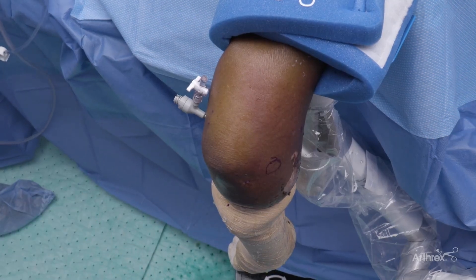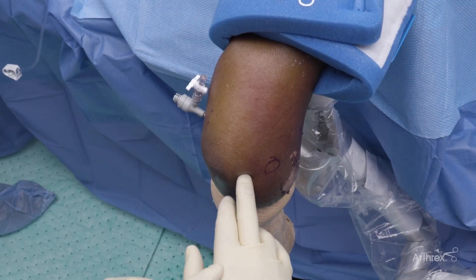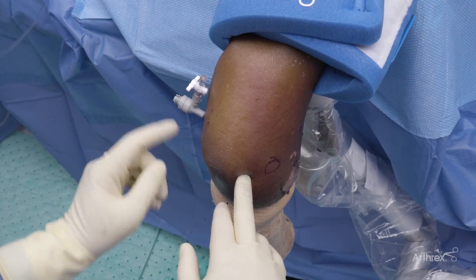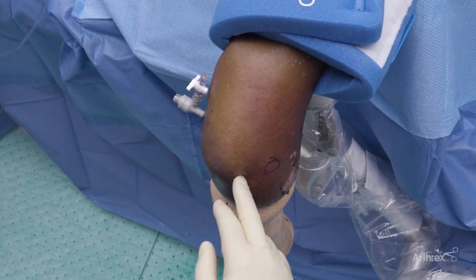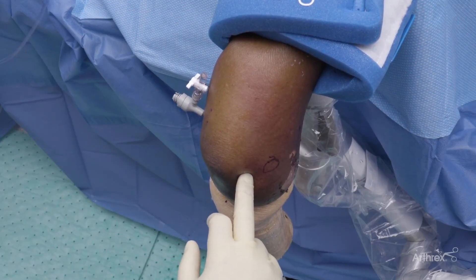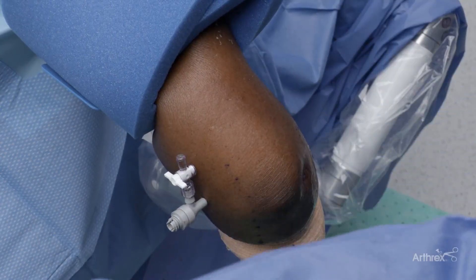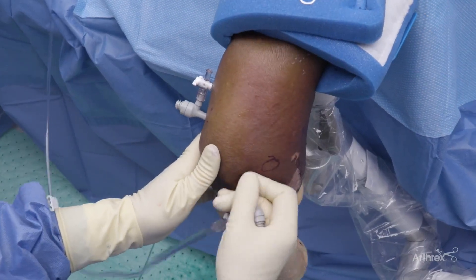After finishing the anterior work, I like to go to the posterior chamber. I use a very straight posterior portal in the radiocapitellar joint. One of the reasons I leave an anterior cannula when I first do this is that sometimes there's a loose body in the trochlear groove or radiocapitellar joint, and it'll have a bad habit of floating anteriorly. So it's nice to leave that in case you have to chase it. Once I'm comfortable, I can go ahead and remove that anterior cannula. We take our small incision and place our cannula in the joint.